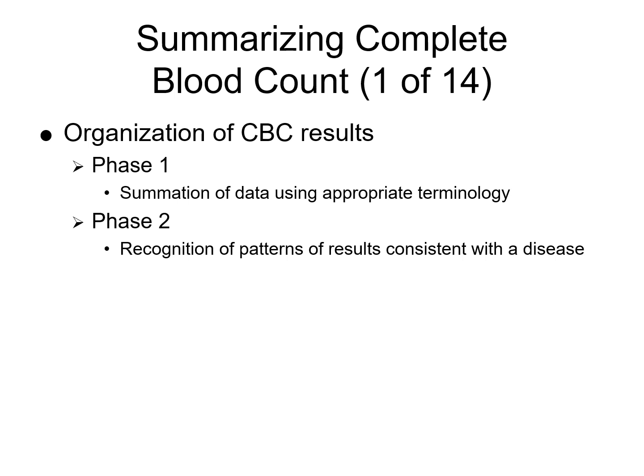Phase 2 is the recognition of patterns. In this phase, the clinician or laboratorian identifies patterns in the CBC results that are consistent with specific diseases or disorders. So recognizing these patterns can help guide diagnosis and further testing for the patient.